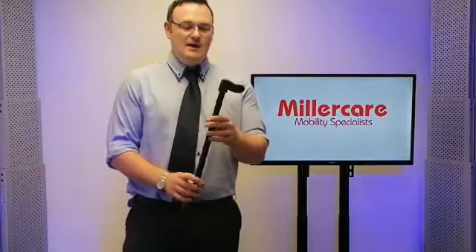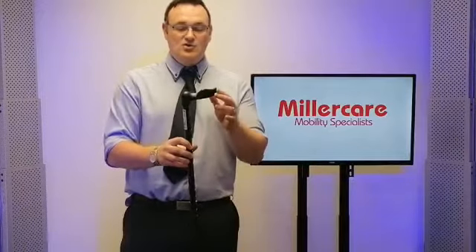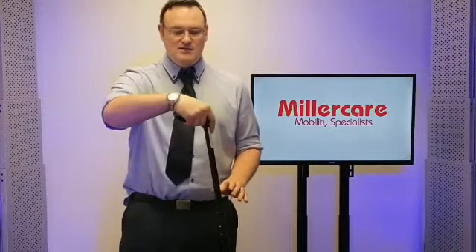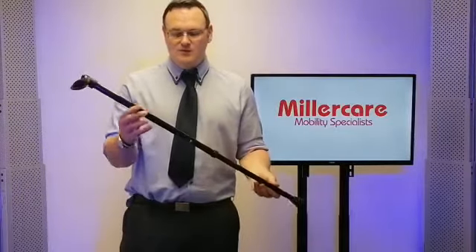With walking sticks we have a variety of different ones. We have a right-handed fischer stick as we would call it, also known as a palmer grip. It just allows a person's palm to nestle inside there if the person's struggling with arthritis. Again, heavy-duty ferrule on the bottom and levels of adjustment with the pop-lock system.